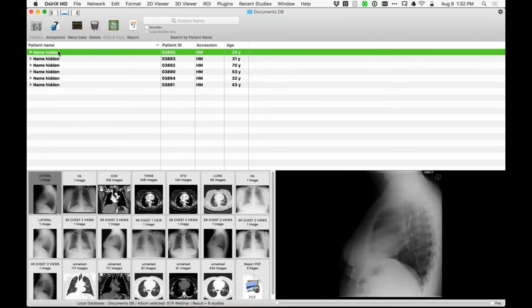Okay, let me show you number 1. Let me see what this one is. Okay, just give me a second.